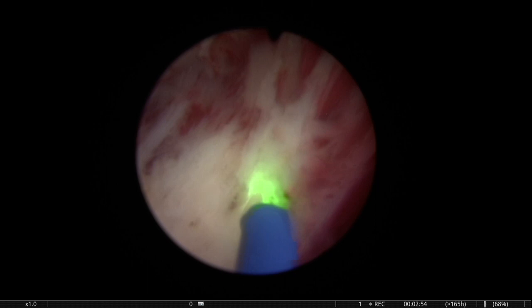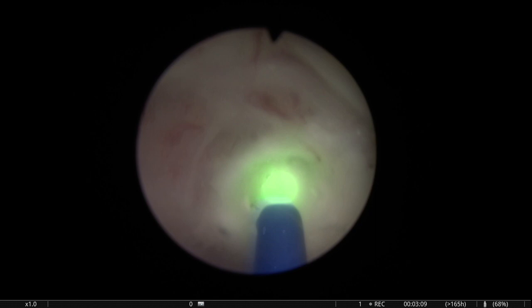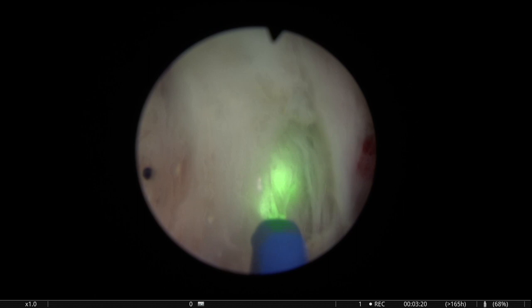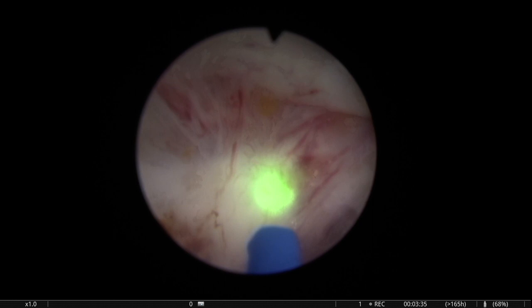So here, as you've seen, the marking of the white line at the edge of the sphincter. You know that some people are looking for this white line. When they see these videos, they think, where is the white line? No, the white line is the line you mark to delimitate the sphincter limit with the apex. There's no anatomical landmark that is a white line that you have to follow. You have to recognize where the sphincter is, and you have to mark this white line, which is going to serve as a reference for the rest of the procedure.